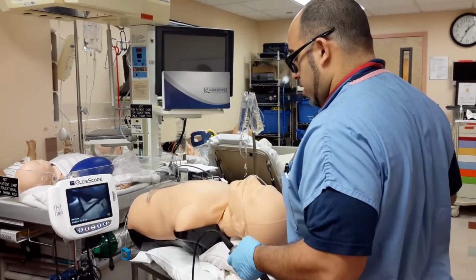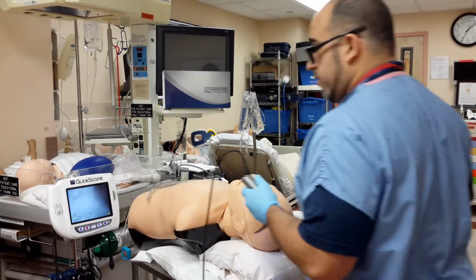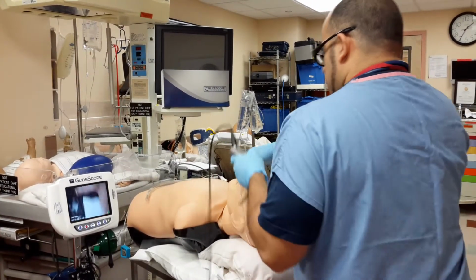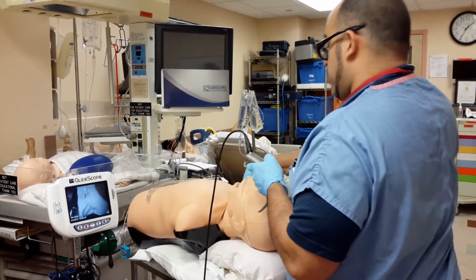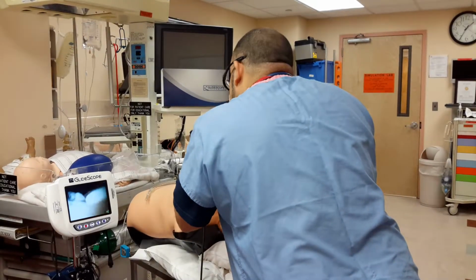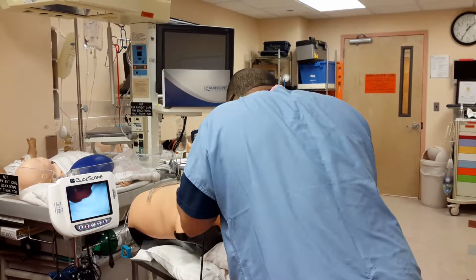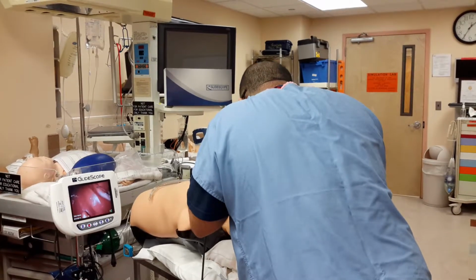So, I think I'm ready to intubate. I have everything ready. Medicines have been given. Get in your combat stance, your ready stance. Okay? I think the case is ready for intubation. Okay. Open the mouth of the patient. I'm going to disregard this monitor because I'm actually going to try to use this blade like I use a regular Mac blade. I see the glottis. Oh, I saw it. No, I saw the uvula. Watching down the tongue.